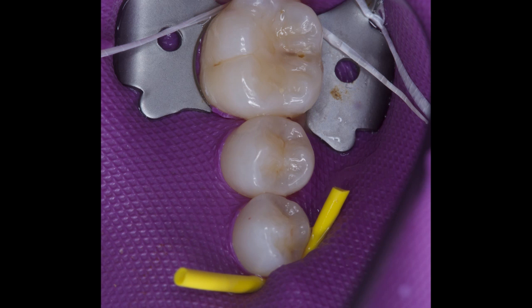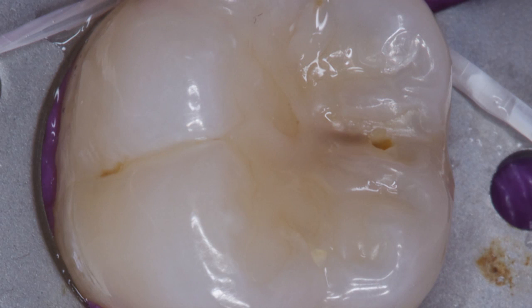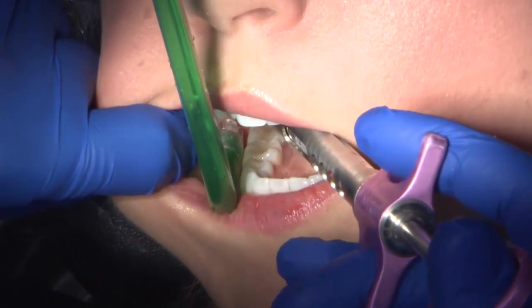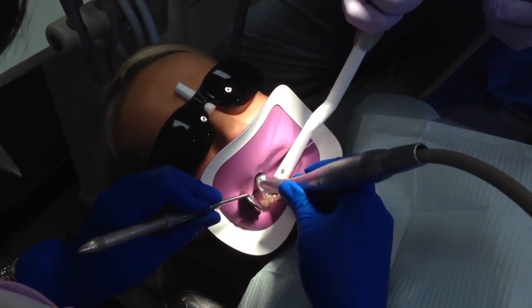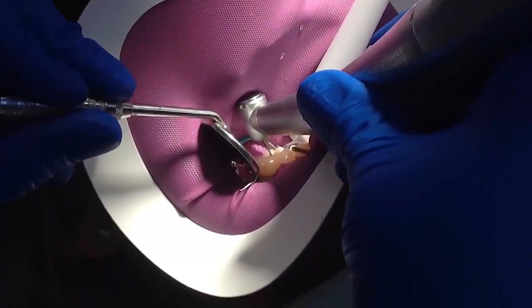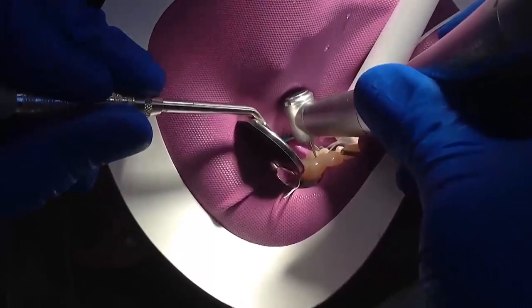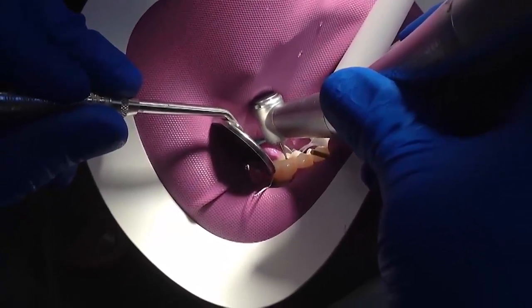One relatively small cavity lesion in an otherwise intact arch classifies Megan as a patient with low risk for dental caries. Using local anesthetic with vasoconstrictor, she's getting Megan ready for the procedure and to receive the rubber dam. The rubber dam is preferred because it controls soft tissue and increases visibility and access. It's considered essential to have a dry field to prevent cavity contamination by oral bacteria and to attain the best marginal seal for the adhesive restoration.